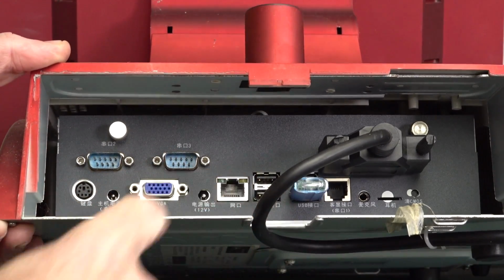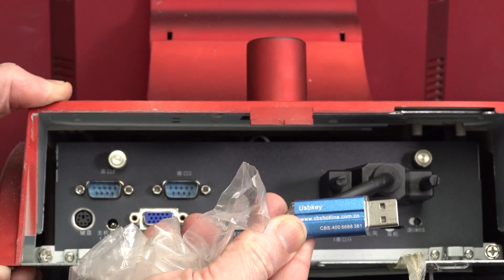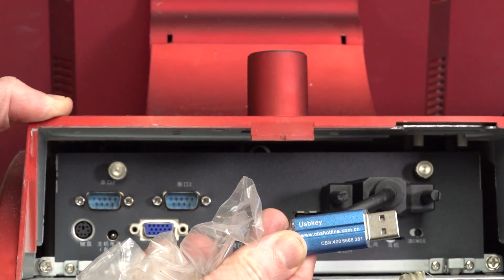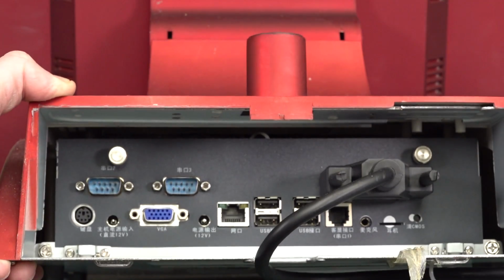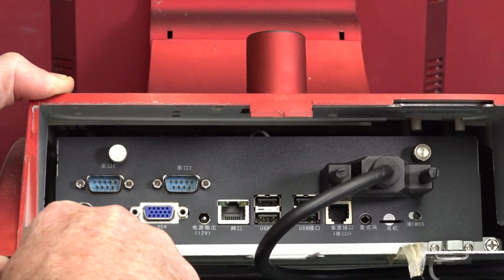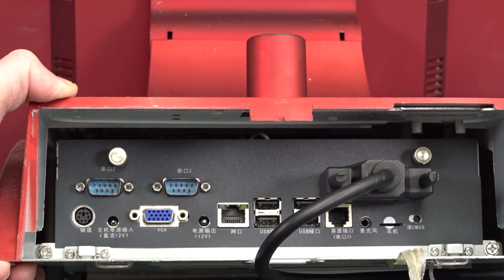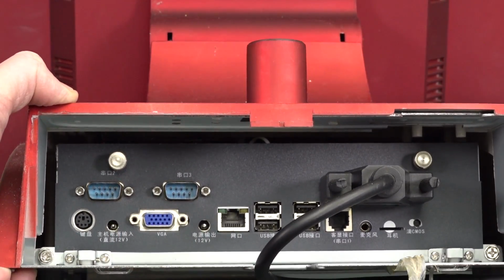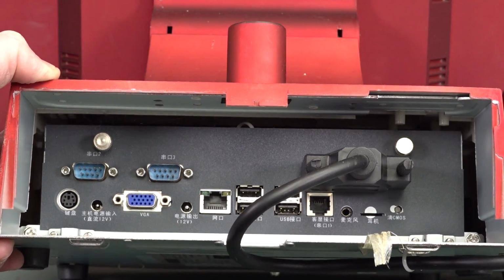So it's obviously got some sort of PC inside this thing. You've got the Ethernets, the USBs. It's already got a USB key in it. CBShotline.com.cn. So it's a Chinese thing. You can see all the Chinese writing in there. It looks like, is that a PS2 port? It looks like 12 volts here. I assume that is 12 volt power to this thing. It runs off a 12 volt plug pack, I'm assuming.